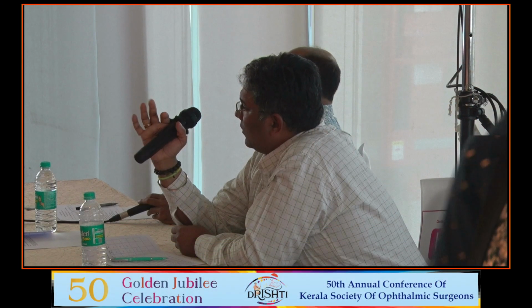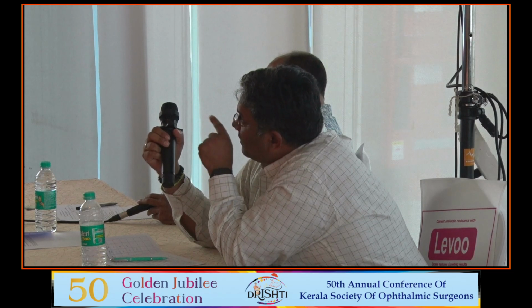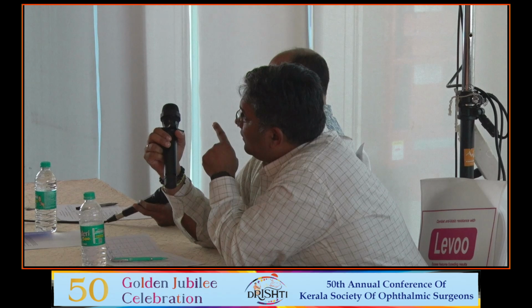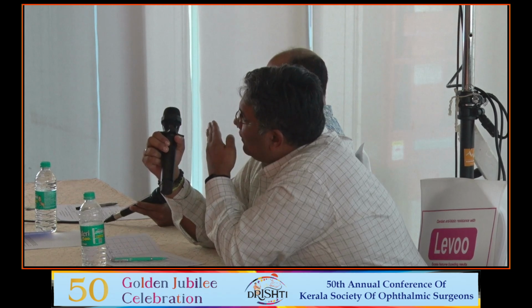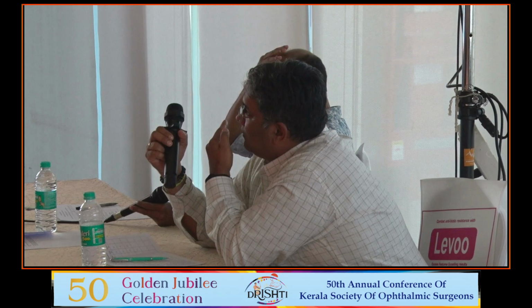Yes, sir. Now, the reason why I'm asking this question is because in the ASOCT picture that you showed, there was more of this subepithelial reflectivity, right? In the adenoviral ASOCT, you showed that. But the problem here is that the particular ASOCT findings that you're seeing are towards the later part. Understood? So you can't use only that as your diagnosis.